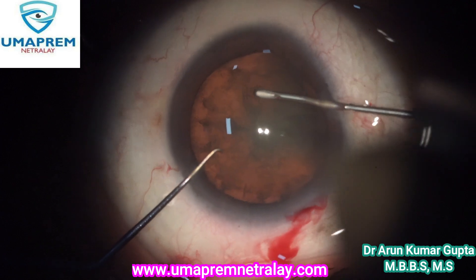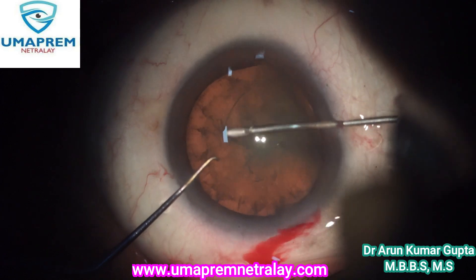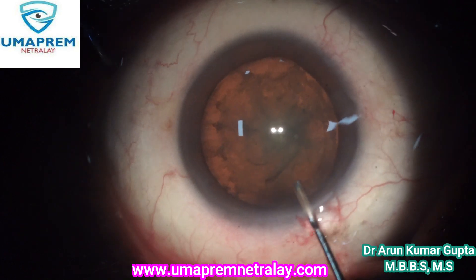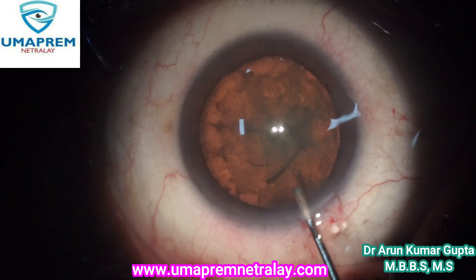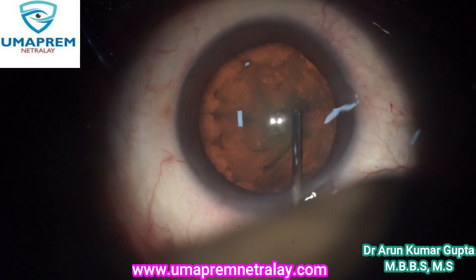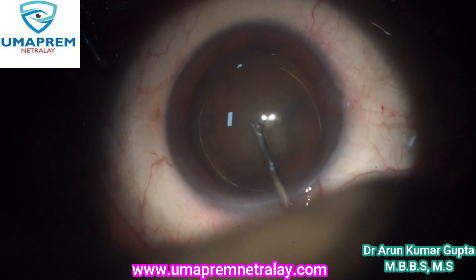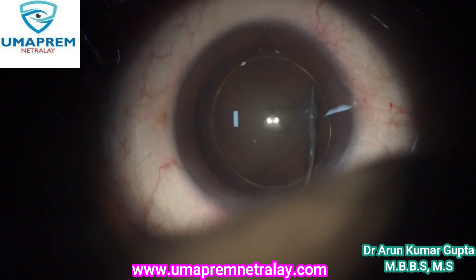After doing paracentesis, we start capsular access under retroglow illumination. You can see the better red glow under retro illumination mode of the microscope.